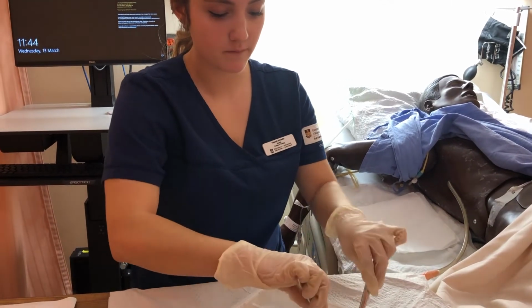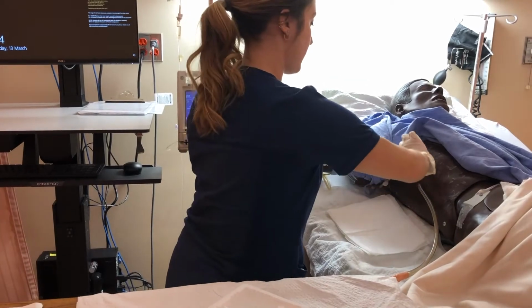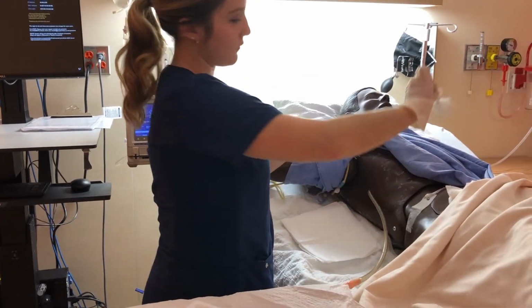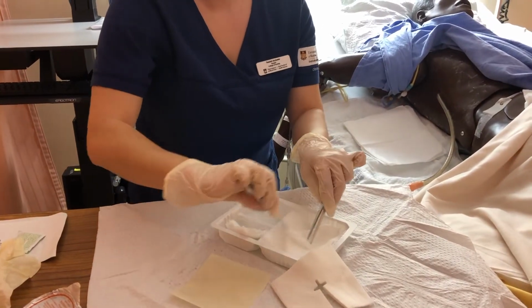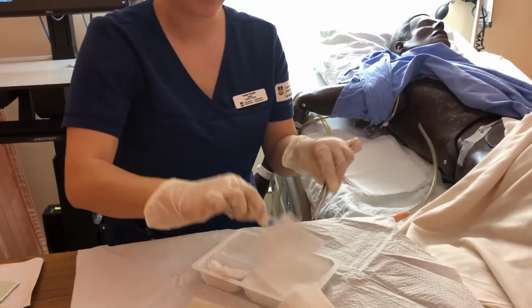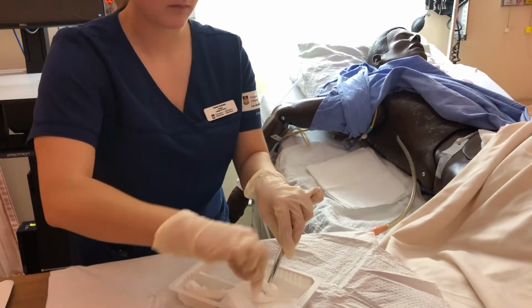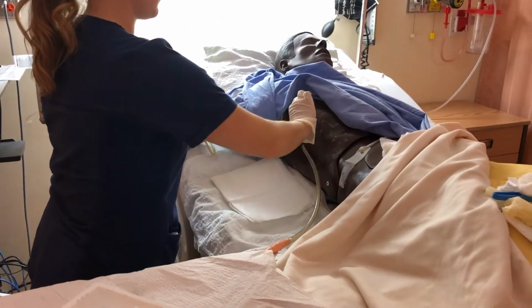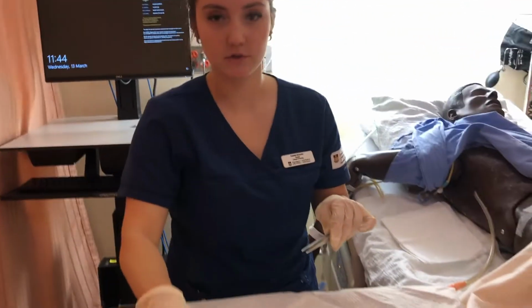And the PIN number is 1234878. So I've got my identifiers there, so I've ensured that I have the right patient. Okay, now I'm going to start doing my safety checks. First, we're going to turn on suction. Okay, so that rolled. That's dry. So now I'm going to place my adaptic dressing.